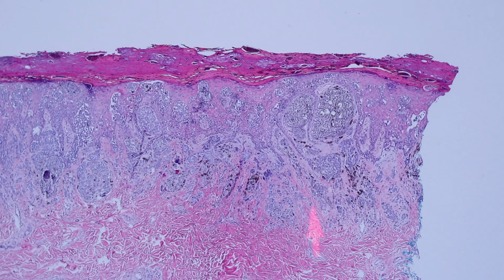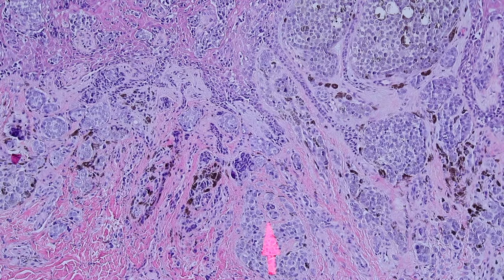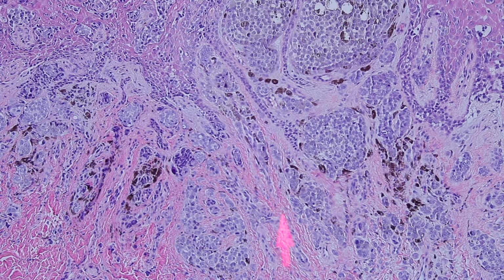So that pattern is called maturation, or zonation, some people say. The term maturation goes all the way back to, I believe, Dr. Unna in the late 1800s, who came up with this idea, and the theory was that nevi start as junctional things and then move down into the dermis and mature. We now, I think, biologically understand that that's not actually what's happening in nevi, but the term maturation is so widely used and understood in dermpath that we still use it, even though it's probably not technically accurate at a scientific level, okay? But it certainly is a useful tool morphologically, one of the points you can use to determine if you're dealing with a melanoma or a nevus.